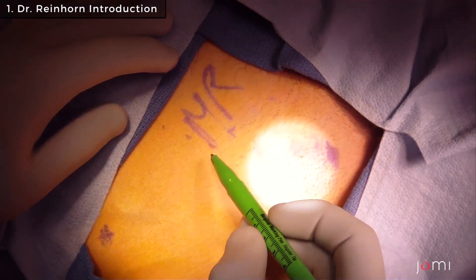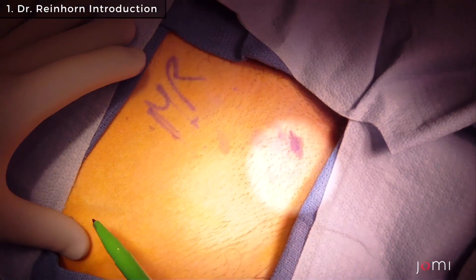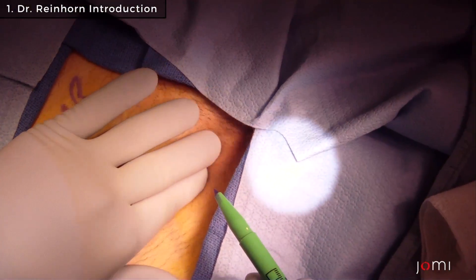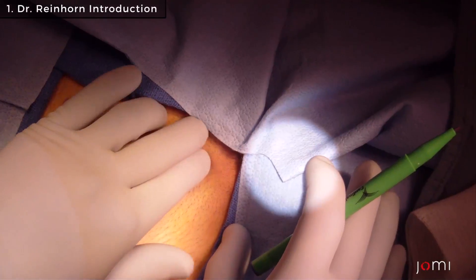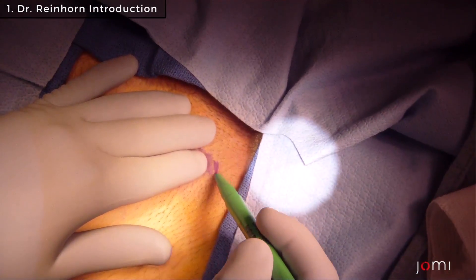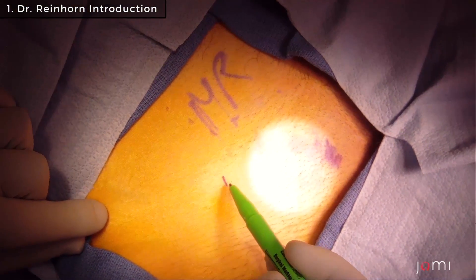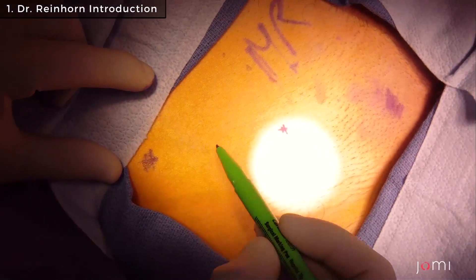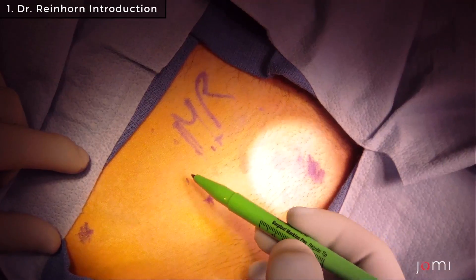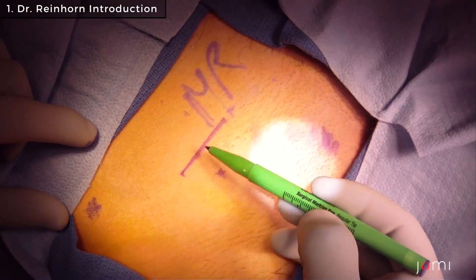Once we know the bony landmark — this is the pubic tubercle here — I'll choose the midpoint between the anterior superior iliac spine and the pubic tubercle. I eyeball that, go about a centimeter and a half above, and make my incision two-thirds medial and one-third lateral, so it's about a three and a half to four centimeter incision.